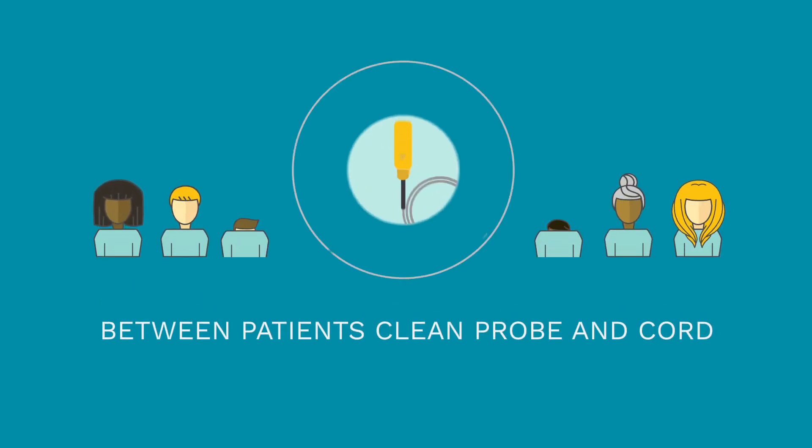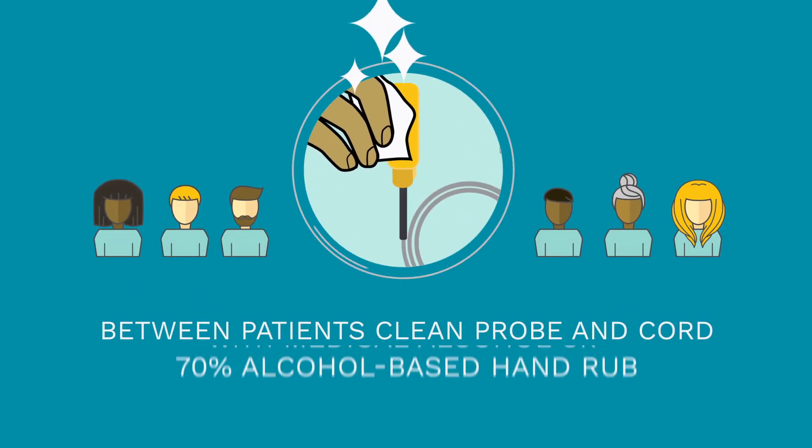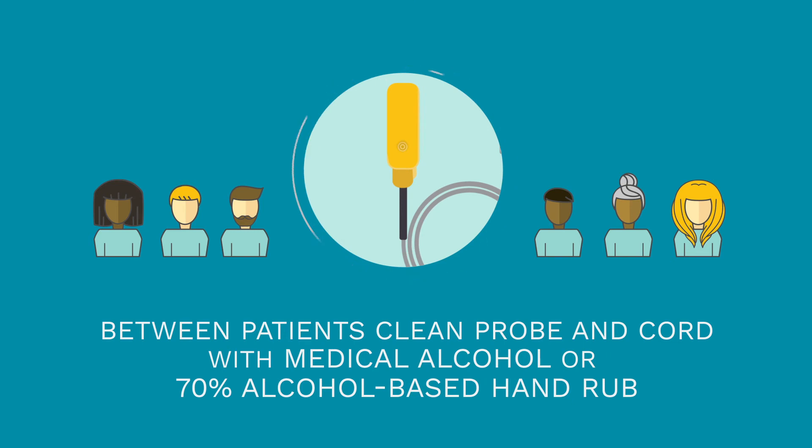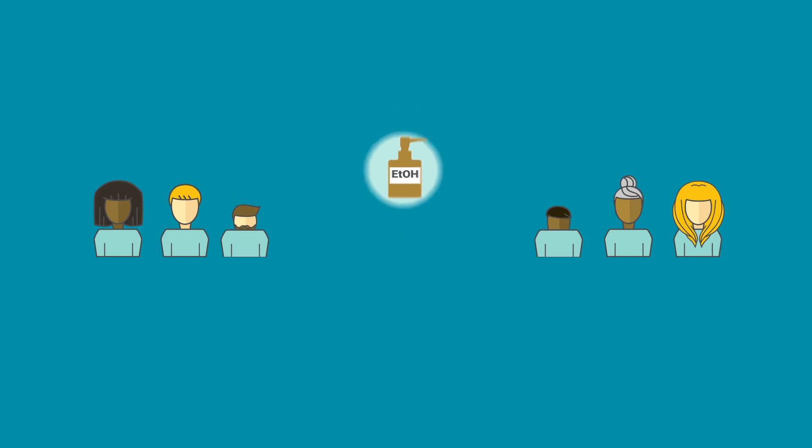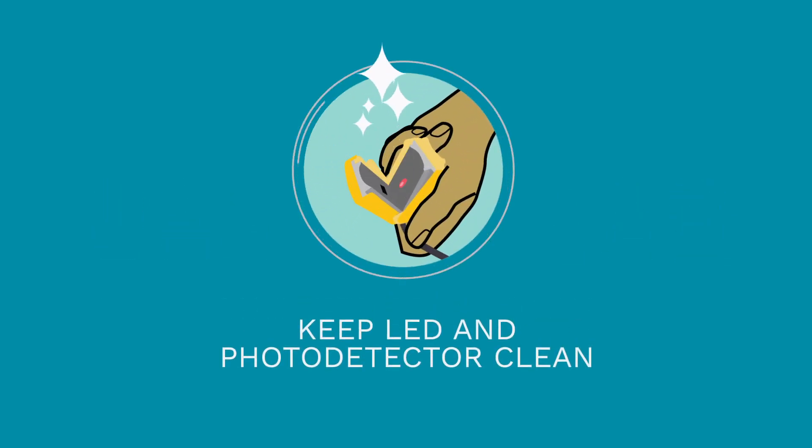Between patients, it is essential that you gently clean the probe and cord with medical alcohol. Small amounts of 70% alcohol-based hand rub will also work, but should be applied sparingly. It's important to keep the LED and photodetector clean.